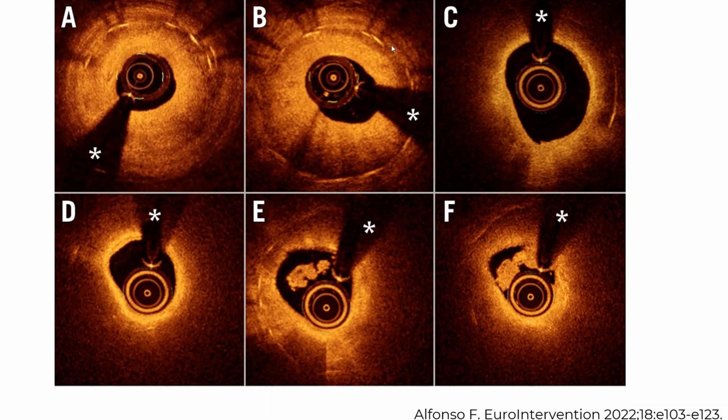Those two are neointimal hyperplasia. This one is actually neoatherosclerosis. You have a thick fibrous cap that is bright yellow, but below it you have this lipid. Remember, by OCT, lipid is this dark, loose structure. It has loose edges and it creates shadowing behind it. It's not well demarcated. That's classic for lipid, what you see here. All this here is lipid.